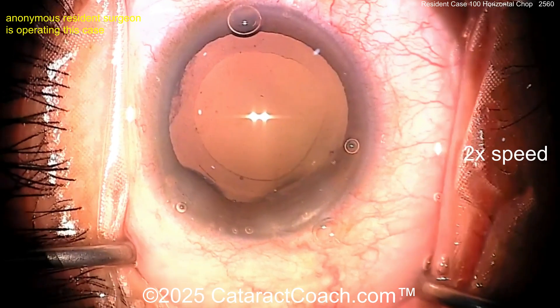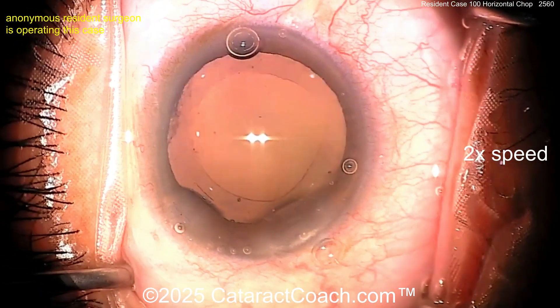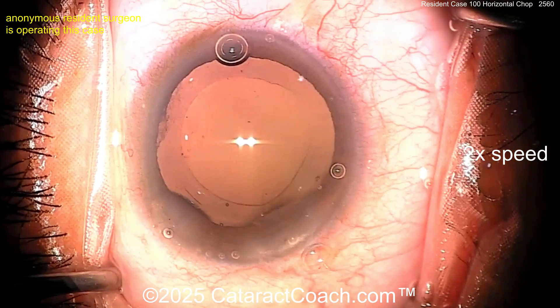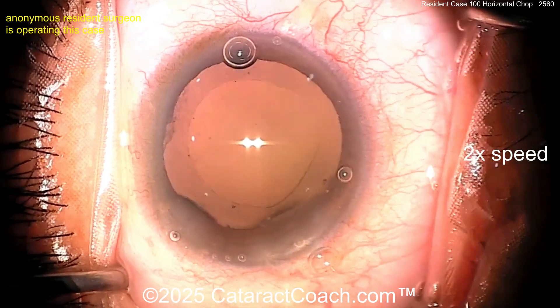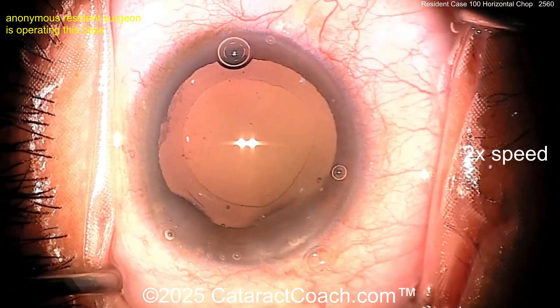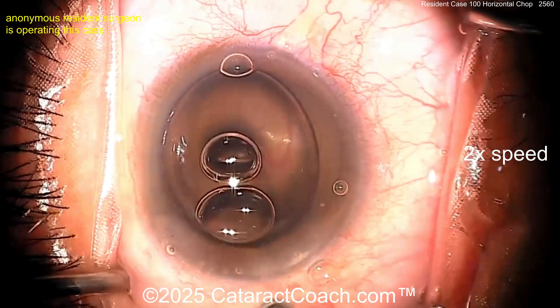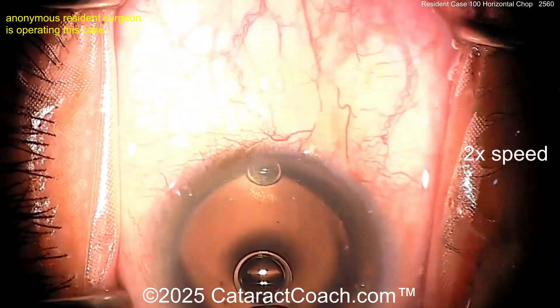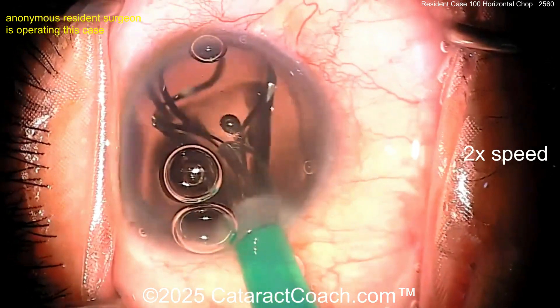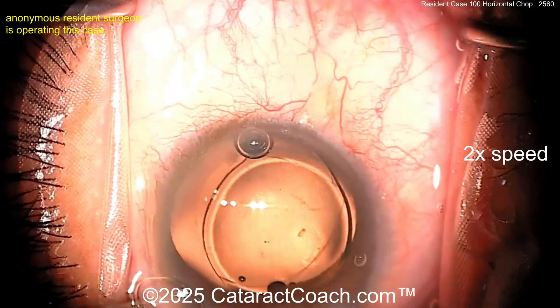Now let's see the lens coming in. The video is at two times normal speed, so the case itself was about fifteen minutes. If you're doing case 100, please take your time — I don't mind if it's twenty or thirty minutes. What matters at this stage is the beauty of the surgery and the control you have, how you're able to float in the incision. Do not pursue speed.